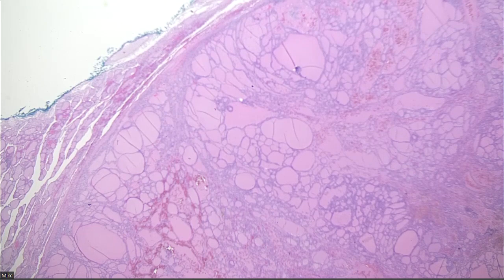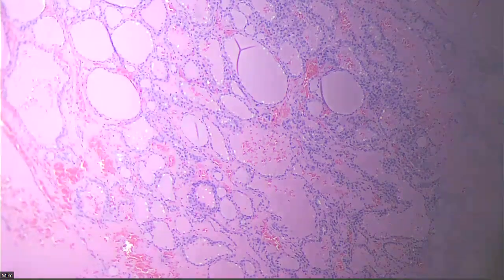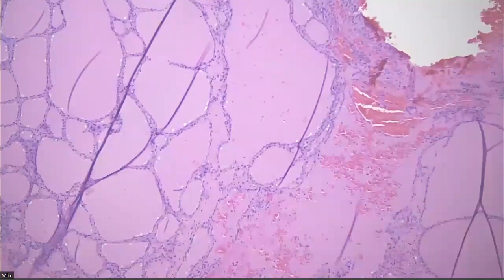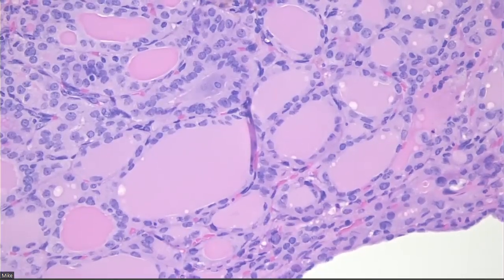Okay, I just wanted to show you a second example of another case that was probably called benign on FNA because it has so much colloid, right? It's so colloid-rich. Well, if you're somewhere out in the world and you start looking, some of you might start seeing some wrinkles and grooves and irregular nuclear contours in a macrofollicular lesion, right? So now we're getting even farther away. We have follicles, but we have wrinkles and grooves. And this also had a RAS mutation.